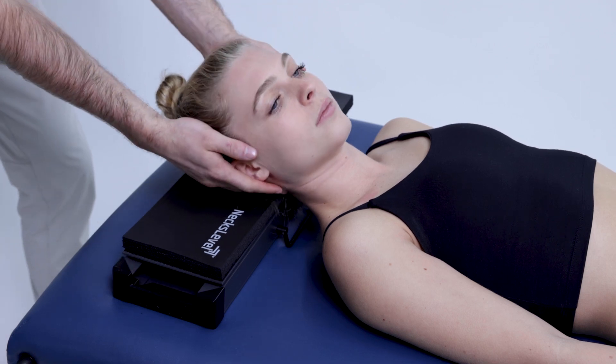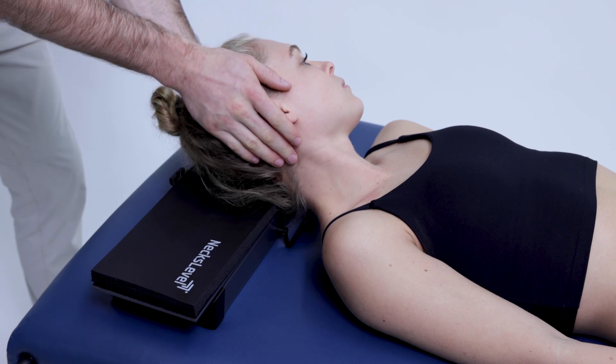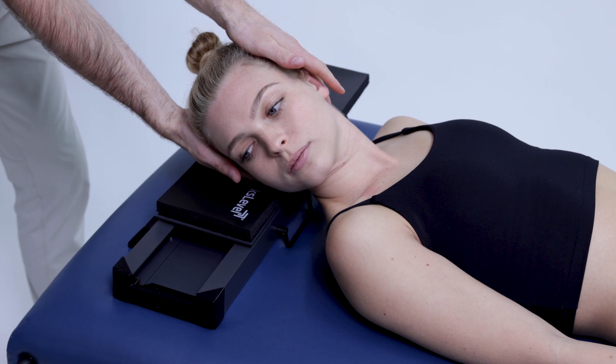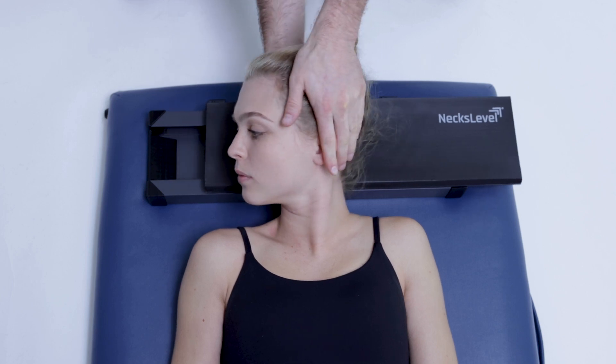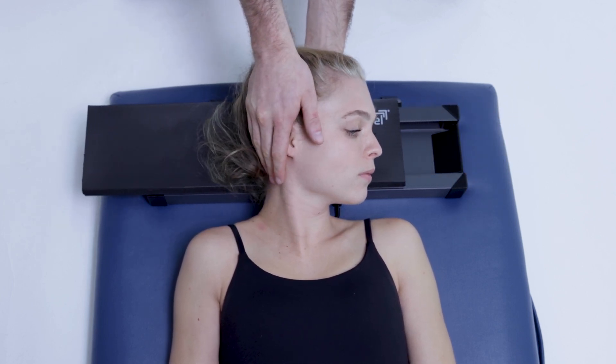Let's start with rotation stretching. Make sure there are no resistance bands attached to the platform to give the user a smooth and relaxed ride. Place a hand on either side of the head and gently rotate left and right, assuring the user is relaxed. Keep their head heavy on the platform to help with this. Move through their available range of motion and provide over pressure as needed.